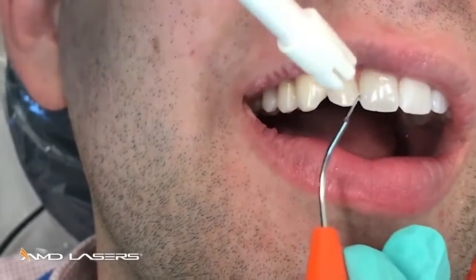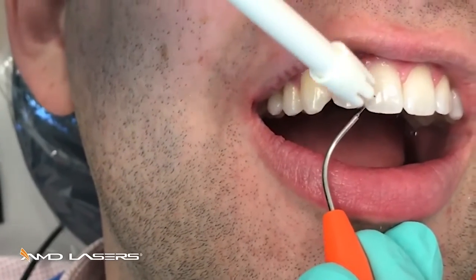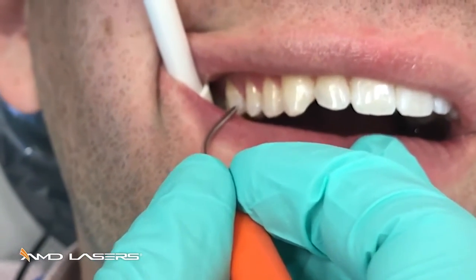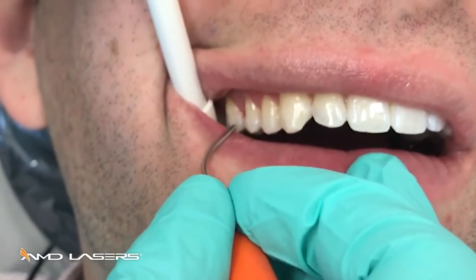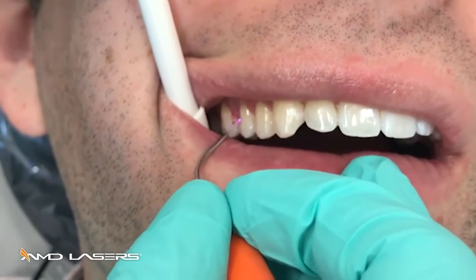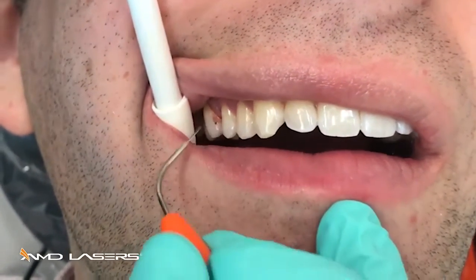As I pull out, the diseased tissue is starting to coagulate on the tip slightly, so I'm at a good working level. I'm going to go back into the pocket, back up about a millimeter so I'm not dragging it to depth, gently against the tissue, and fire. The laser tip is just gently against the diseased pocket wall, pulling off the granulated, diseased tissue in the pocket wall. That's your goal.